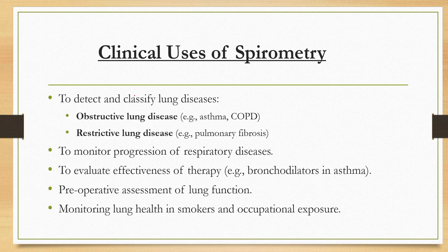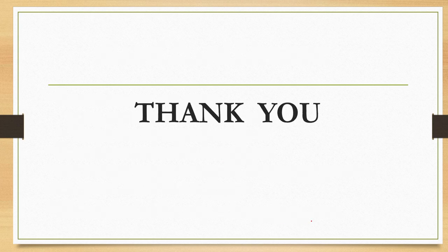Uses of spirometry. It is used to detect and classify lung disease. Obstructive lung disease, for example asthma and COPD. Restrictive lung disease, for example pulmonary fibrosis. It is also used to monitor the progress of respiratory disease and to evaluate the effectiveness of therapy, for example bronchodilators in asthma. It is also used for preoperative assessment of the lung and to monitor lung health in smokers and those with occupational exposure. Thank you.